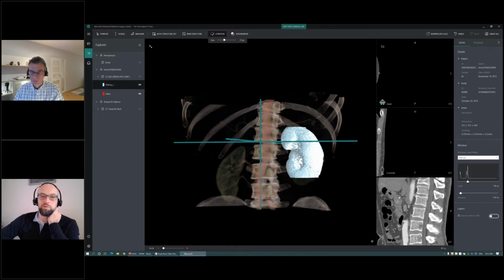We've decided to share this tool with the community, and my team is working right now on releasing this tool eventually as an open source tool, but right now it's available on a limited preview basis. If you're an organization that has the need to label medical imaging data sets, please contact us, and we'll happily share it with you.